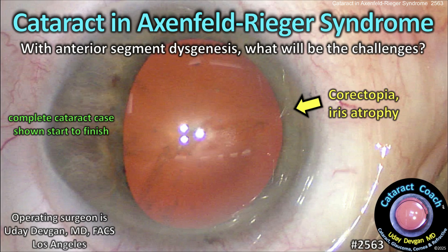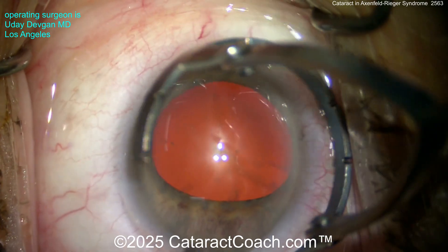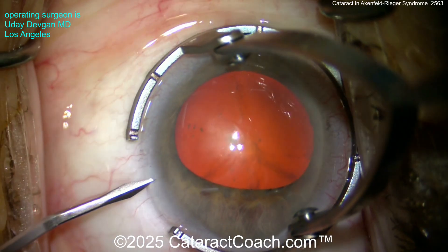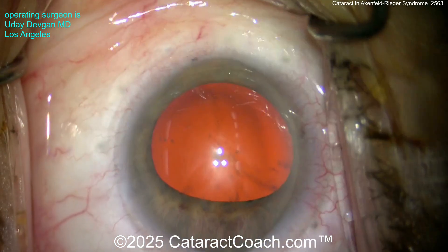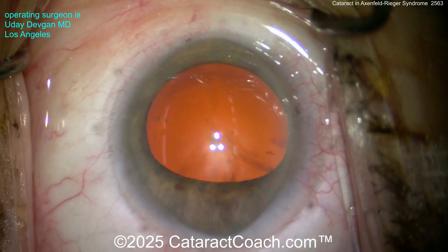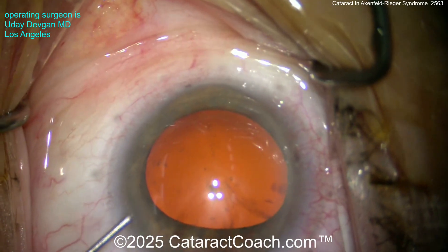cataractcoach.com — cataract surgery and Axenfeld-Rieger syndrome with anterior segment dysgenesis. What are going to be the challenges here? Let me show you this case. This is me operating. Look carefully at the eye — you'll notice it's very odd. The cornea is not very round; it's kind of rhomboid shaped.